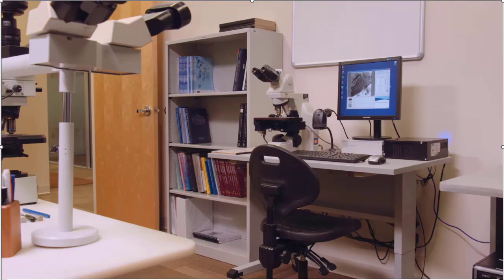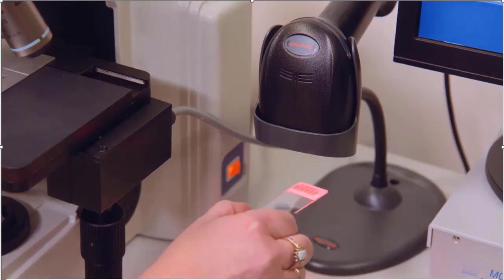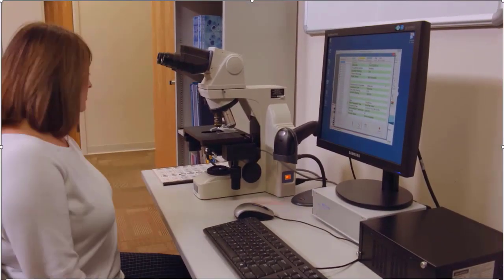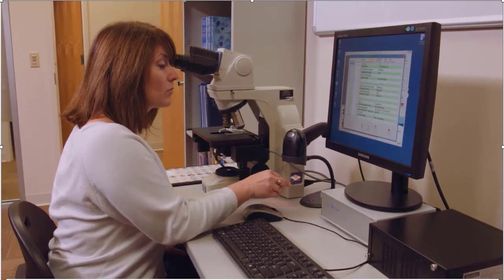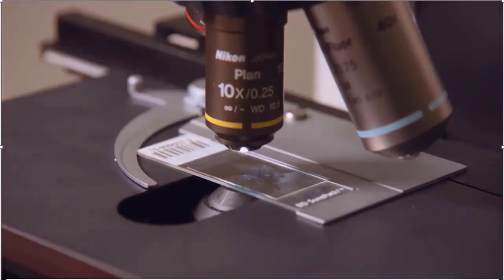Components consist of a monitor, keyboard, mouse, automated microscope stage, computer, barcode scanner, and an optional foot pedal. To begin screening at the GS review station, a slide is scanned by the barcode scanner and loaded onto the BD FocalPoint GS review station.